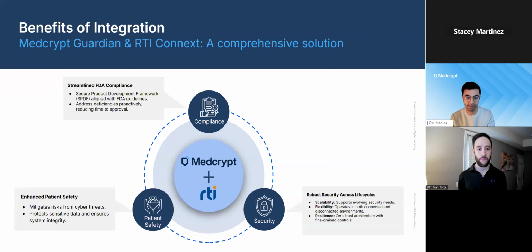While cybersecurity ends up being a lot about protecting against hackers, it also improves system integrity. When we're talking about cryptography-specific terms like signing and verifying data, what that's really doing is making sure the integrity of that data is not compromised. So it's really important to introduce concepts like that in the design of your device.